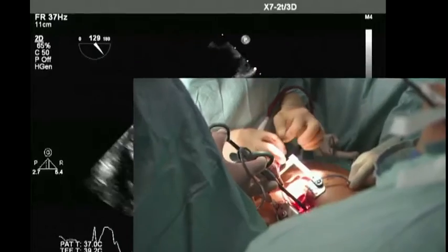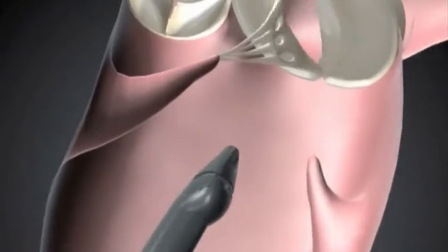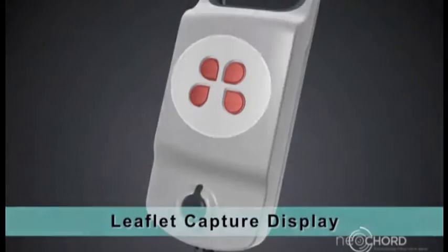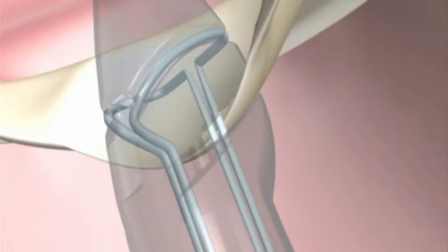The Neocord procedure is performed on a beating heart through a small incision. The DS-1000 slips through the base of the heart, and its tip grabs the damaged valve leaflet. Fiber optics confirm that the leaflet has been adequately captured before the preloaded suture, wrapped around the tip of the device, is hooked and pulled through the heart.